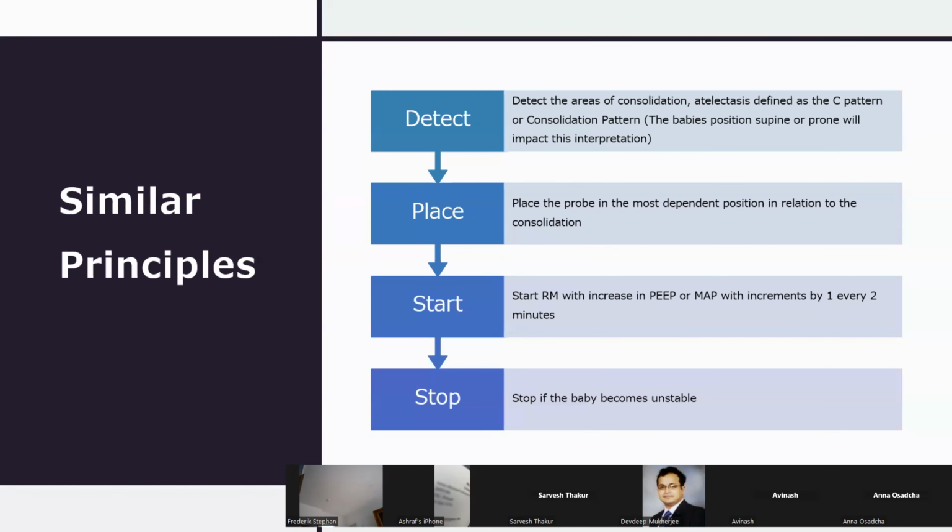I would then put my lung ultrasound on. I like using a linear probe with extended convex imaging because it gives me a much larger footprint. It's much better, with less handling. If I'm using the hockey stick and I can only see two spaces, it gives me much less idea. But more importantly, if the baby is supine, why not give this baby the best possible option? If he can tolerate it, I'd pop him prone, go into that area, keep my probe there, and really start working.